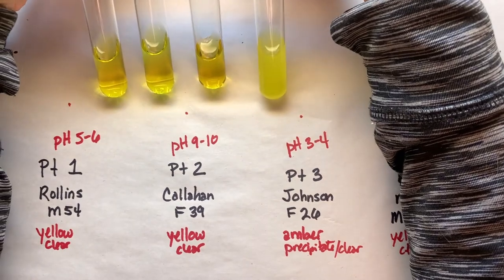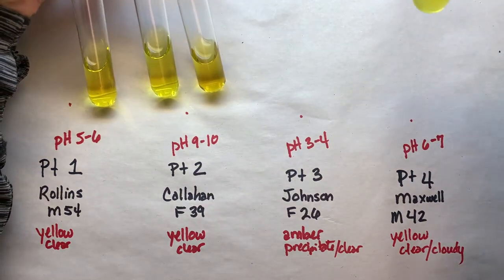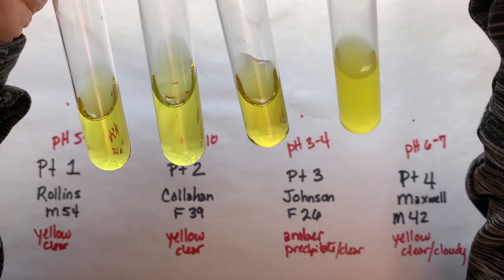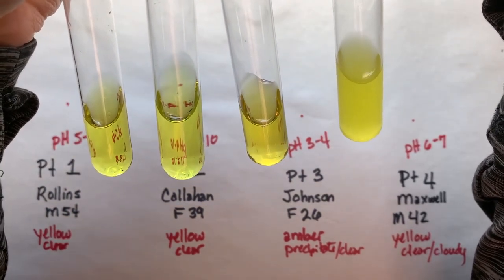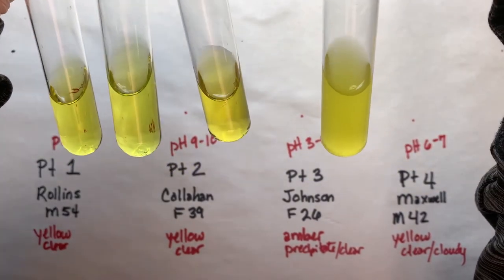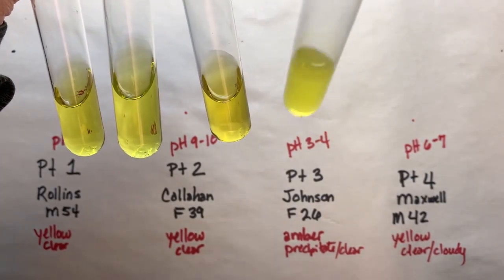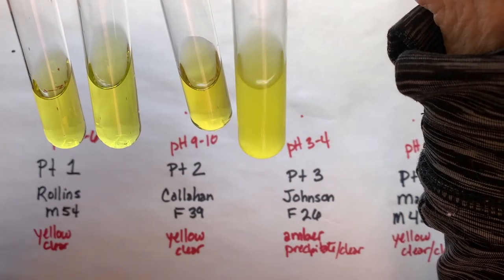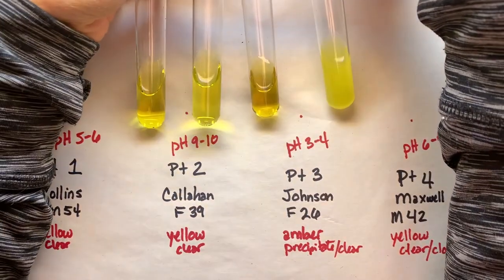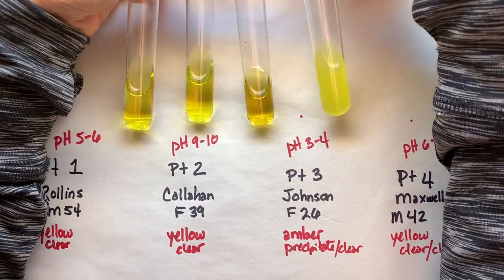What I have are three fairly stable yellow color solutions here. And the number four, can you see how it's much cloudier than the other three? So the first three patients' urine, although number three is just a little bit darker yellow. This fourth patient's urine is definitely different. So we're getting a precipitate in that urine. All right, so there they are, all four of them different, only in the fourth one.